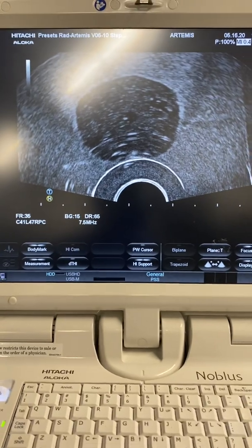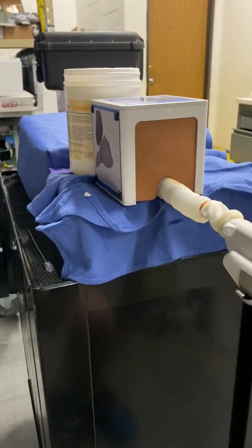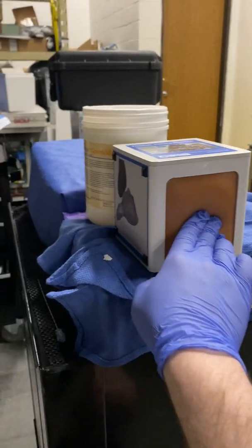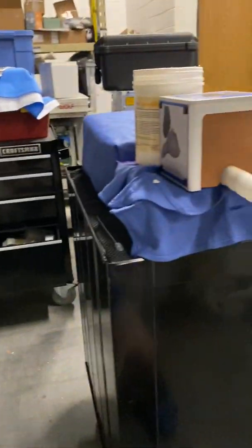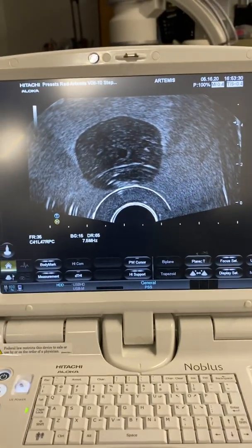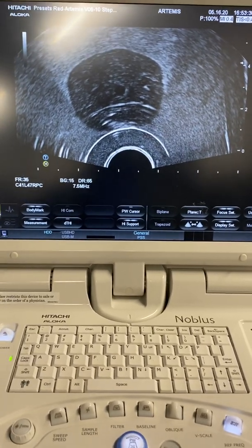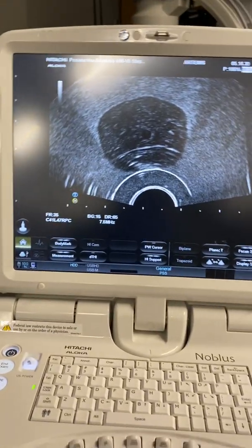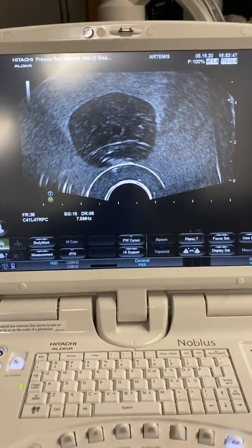That concludes the SpaceOAR procedure. They'll take the probe out freehand — unlock everything and remove the probe. They may hold pressure on the perineum because there can be bleeding from the perineum, holding gauze with pressure. Meanwhile, you're taking the probe cover off, wiping the probe down, and doing your typical reprocessing and equipment turnover. Make sure you fill out a treatment form. We're working on a way to input SpaceOAR procedures so you can enter patient info and mark it as SpaceOAR or fiducial marker — eventually there will be a custom form for those.